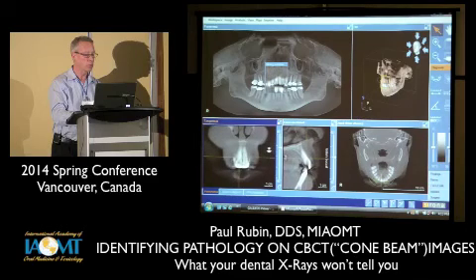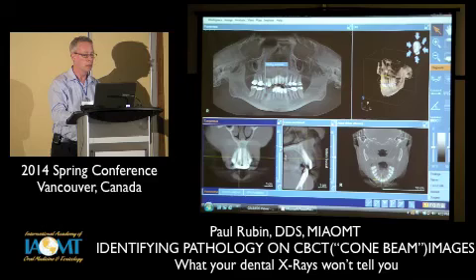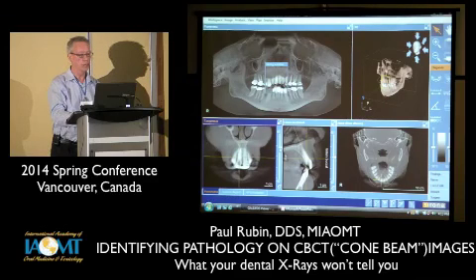Now when we look at this screen on the left, we can see this image more clearly. If I hadn't lined this up this way, this image looks kind of distorted. Is this the question you were asking? Yeah, so probably different brands have different ways of manipulating. This is a neat way that really helps to get a more clear, straight-on view of the tooth, not foreshortened, and you can come from whatever angle you want.